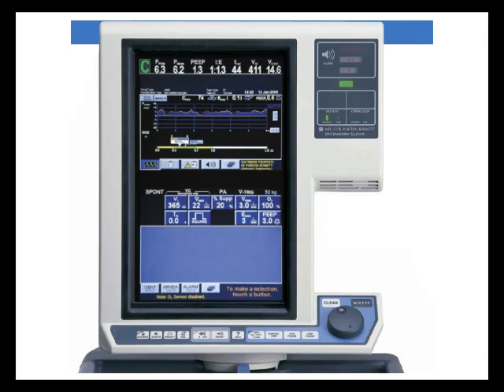Sure, you can look at the pressures. But the peak pressure, the pressure you get automatically on the ventilator, means nothing. Peak pressure is the representation of the endotracheal tube and the large airways, like the bronchi and the bronchioles. They are going to be constricted in this disease, and therefore the peak pressure is going to be very high. It's going to be crazy high.